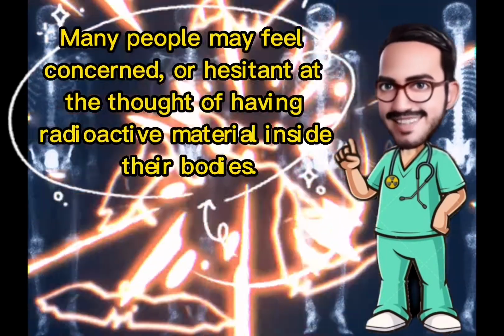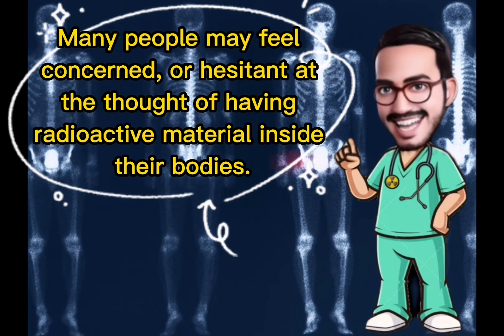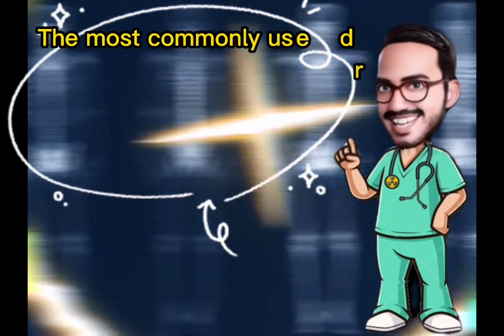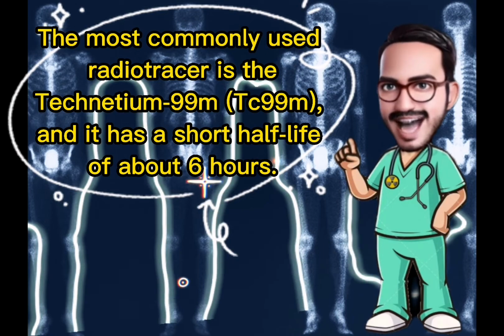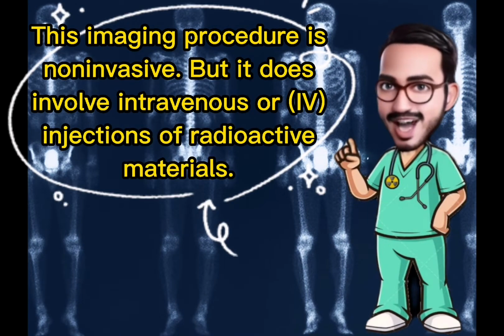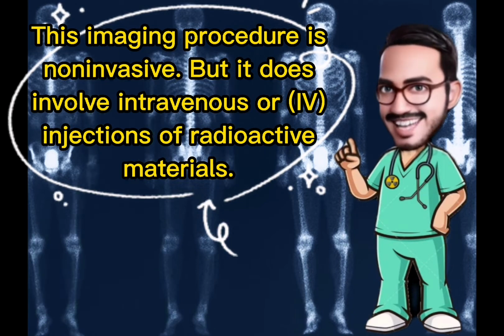Many people may feel concerned or hesitant at the thought of having radioactive material inside their bodies. But a bone scan requires some amounts of radioactive material. The most commonly used radiotracer is technetium-99m, and it has a short half-life of about 6 hours. This imaging procedure is non-invasive, but it does involve intravenous or IV injections of radioactive materials.